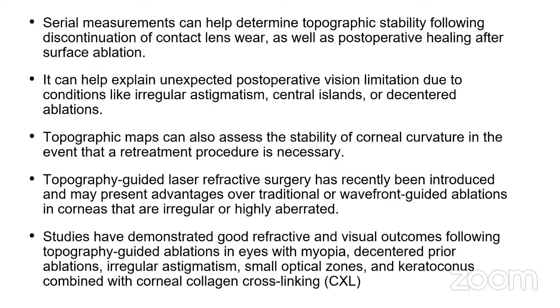Serial measurements can help determine topographic stability following discontinuation of contact lens wear as well as post-operative healing after surface ablation. It can help explain unexpected post-operative vision limitation due to conditions like irregular astigmatism, central islands, or decentered ablations. Topographic maps can also assess the stability of corneal curvature in the event that a retreatment procedure is necessary.